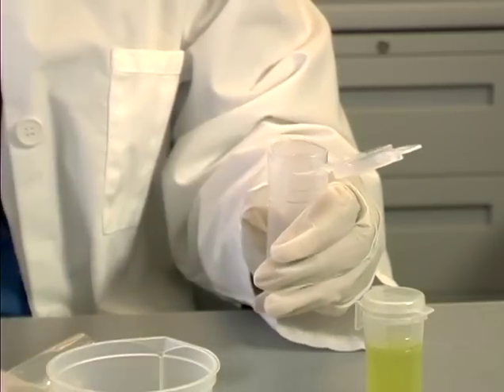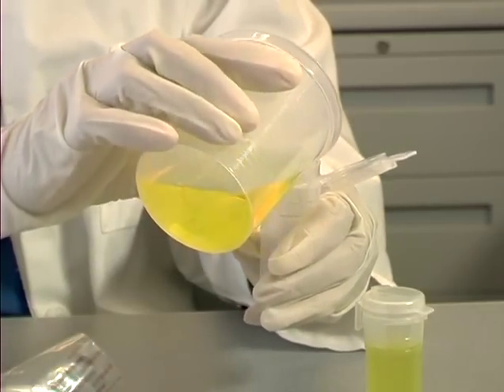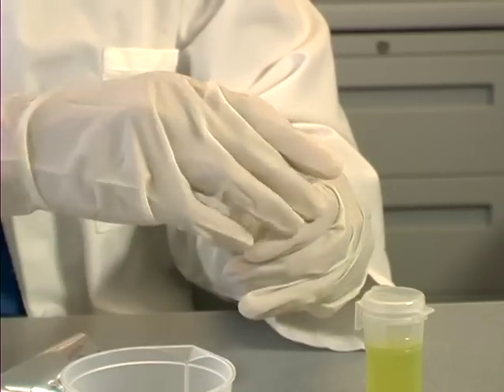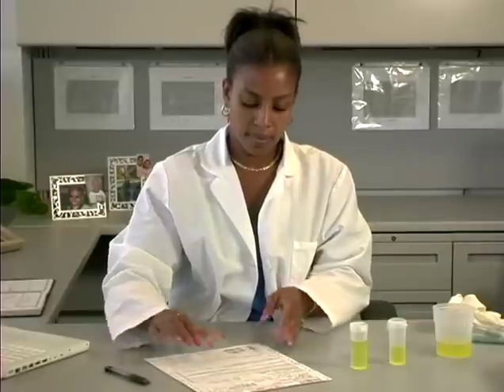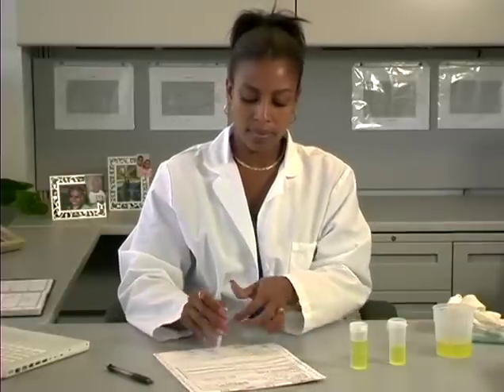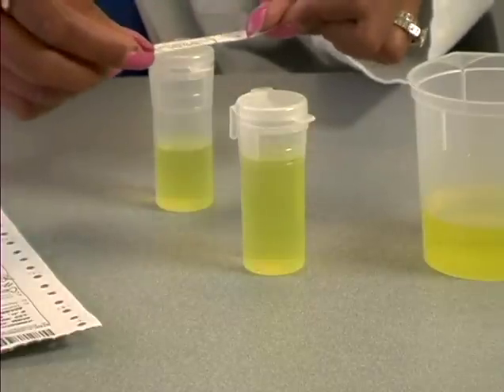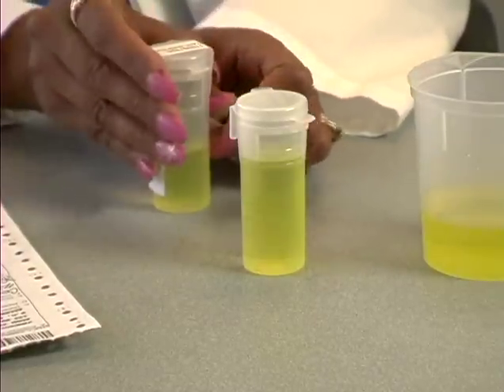Both bottles must be made of leak-resistant plastic and have markings clearly indicating the appropriate levels of urine that must be poured into them. The bottles must be wrapped, together or separately, in a sealed plastic bag, shrink-wrapped apart from the collection container, or they must have a peelable sealed lid or other tamper-evident system. The bottles must have screw-on or snap-on caps that won't leak during shipment. They must also accommodate the required tamper-evident bottle seals from the CCF.